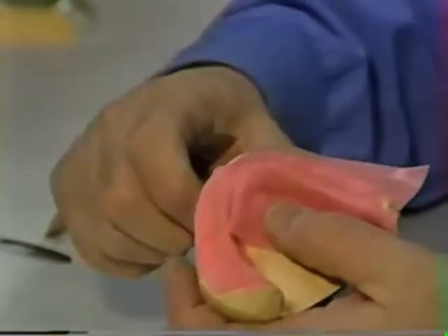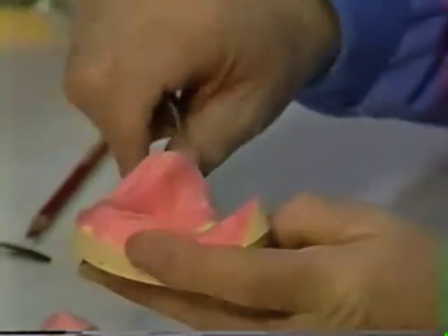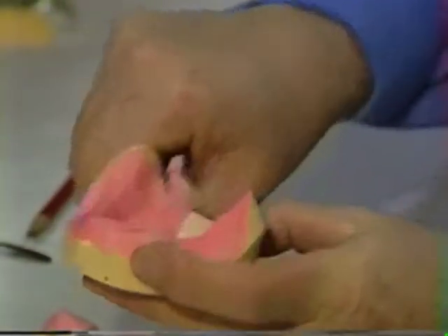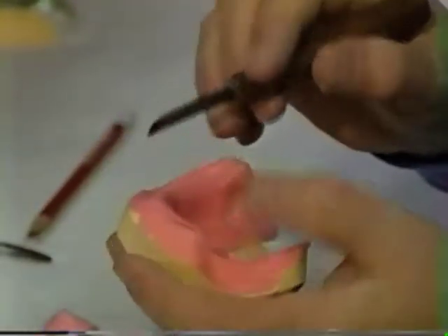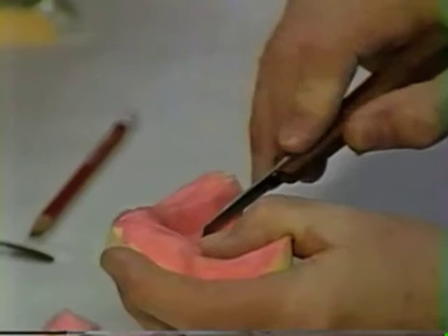Then we take a knife, cut the excess off again. Cut the lingual off. We get rid of this out in the front where it overlapped. And cut the lingual off. Get rid of the excess off of it now.